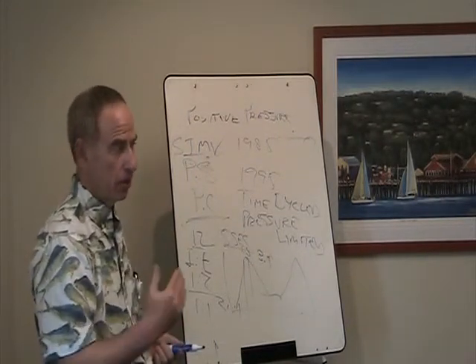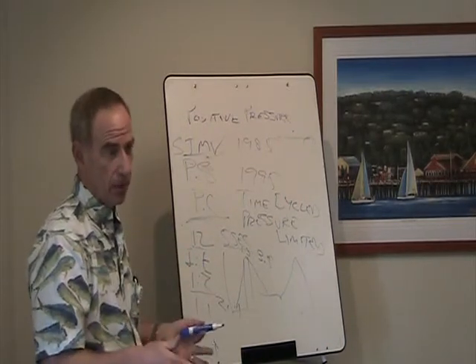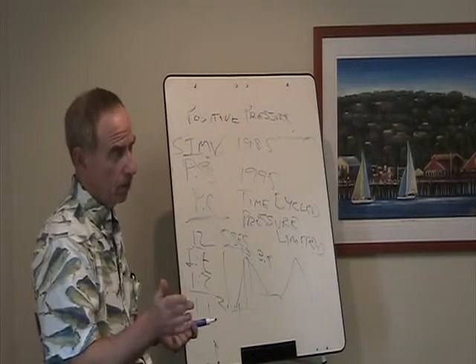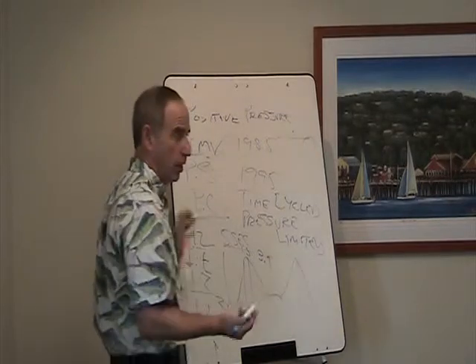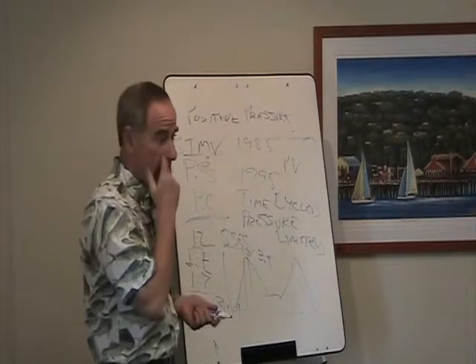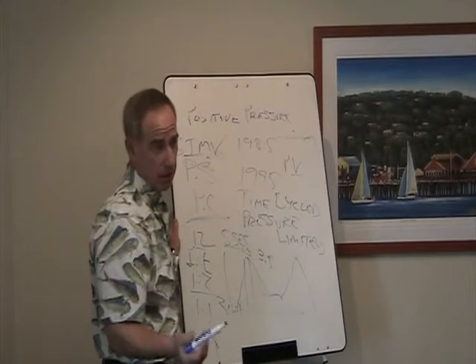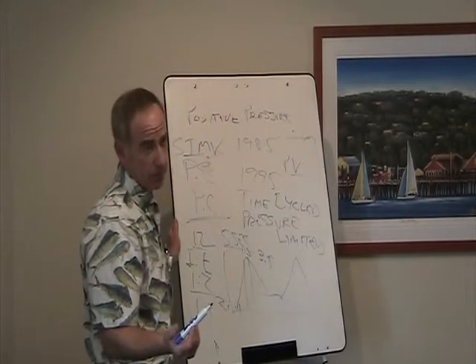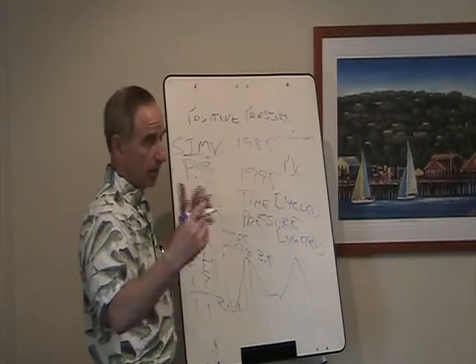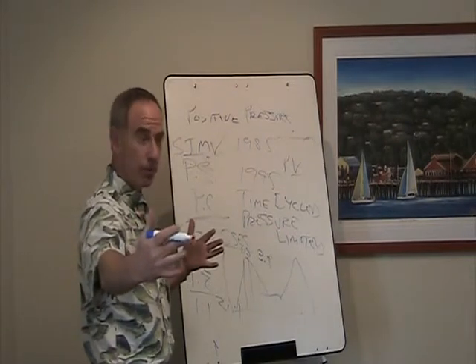The other advantage, though, is that the flow characteristics in this mode of ventilation are different than in volume cycle ventilation. The way the gas is delivered is different. Now, if you think about pressure and volume relationships, the compliance and resistance doesn't change. And if I set a set pressure, I should always get the same amount of volume, right? If the resistance of the lung and the compliance is constant, and I set a certain pressure, every time I give that pressure, you should get a set volume, right?